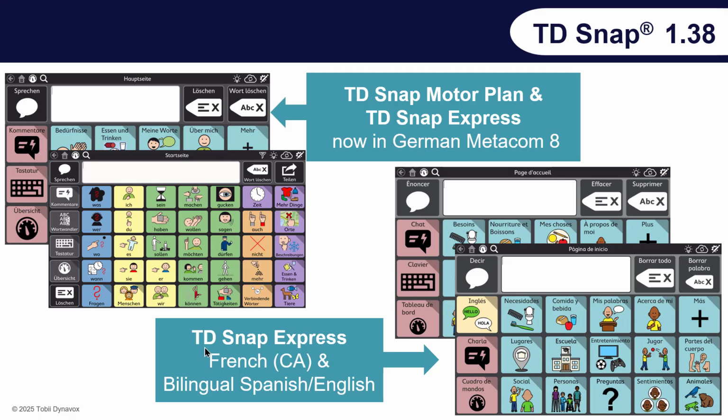And TD Snap 1.38 did bring some new page sets in different languages. So TD Snap Motorplan and TD Snap Express have been released with the German Metacom symbols. And then in terms of TD Snap Express, that's been released in Canadian French and bilingual Spanish English.